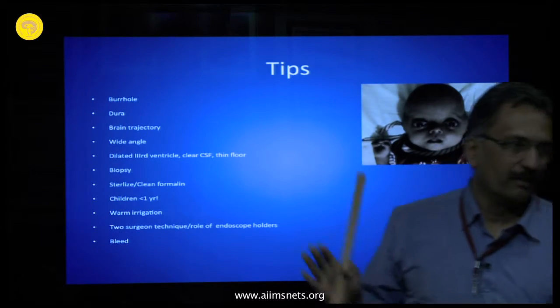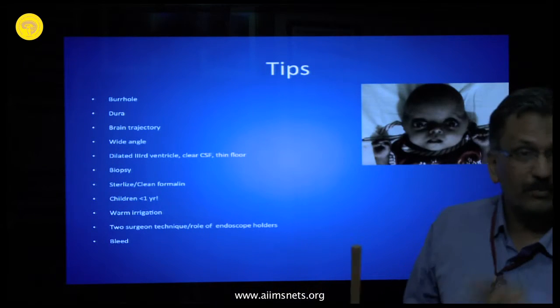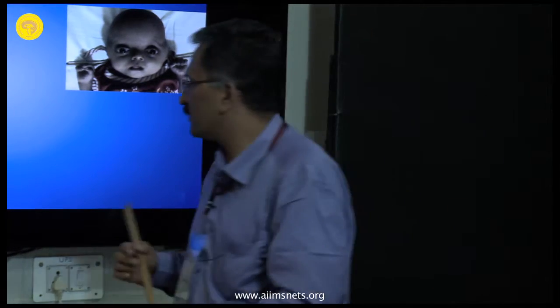The other thing is with children, warm irrigation is important. Because if you just use cold irrigation, these children will become hypothermic. So you must make sure that it's just warm, body temperature, not hot, just body temperature. This is very, very important.